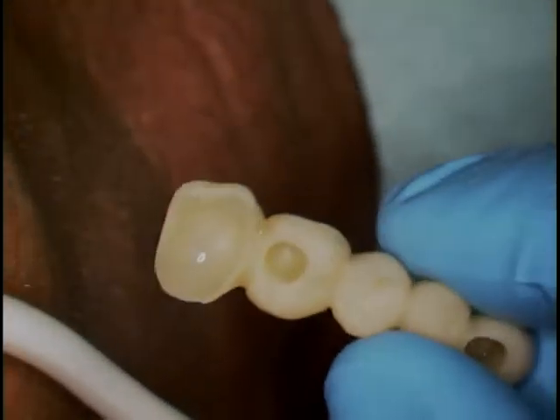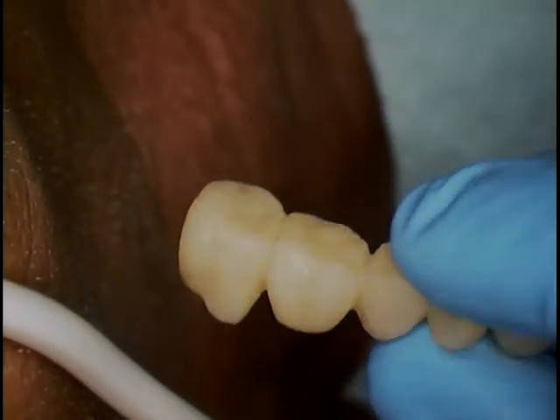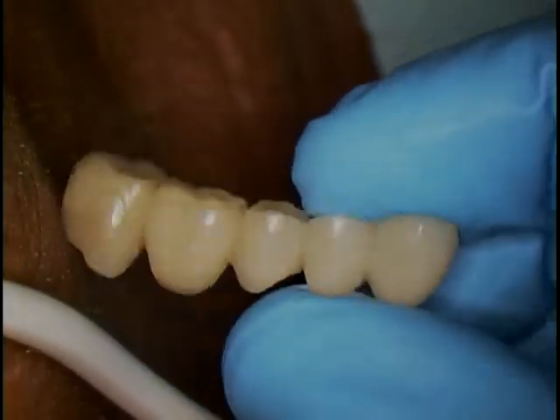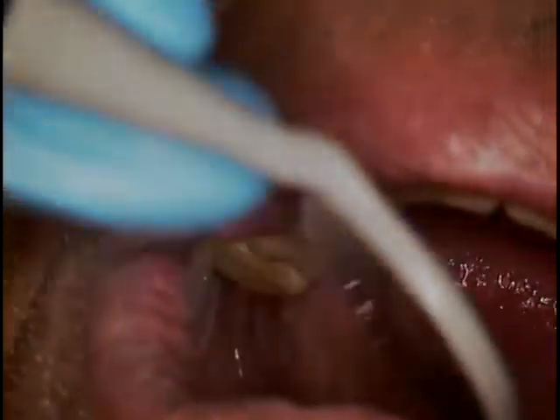This is our provisional. The patient came in with it, and it looks like they added a little bit to the occlusal aspect — a relatively flat plane. We'll come back in and test again.